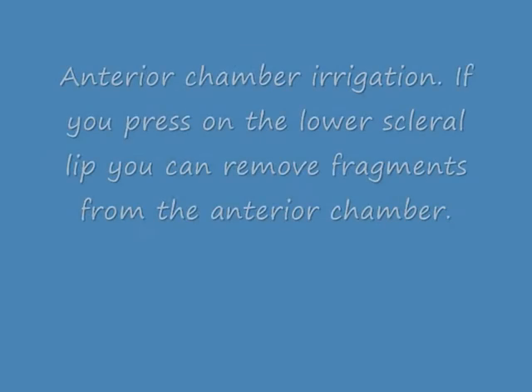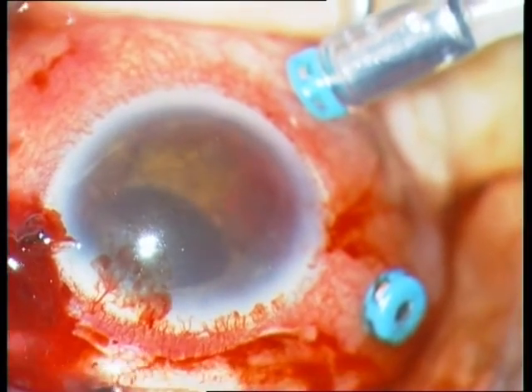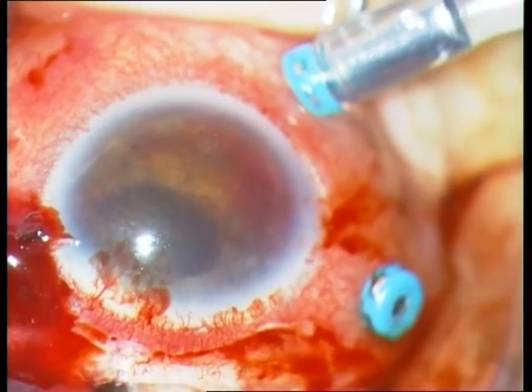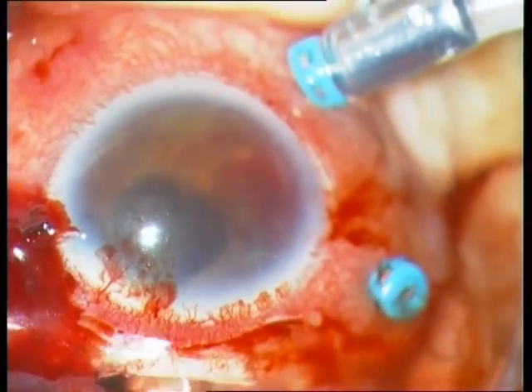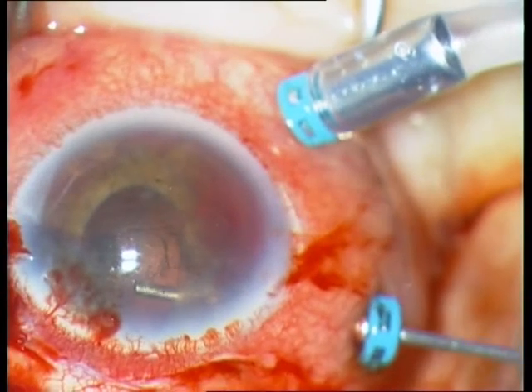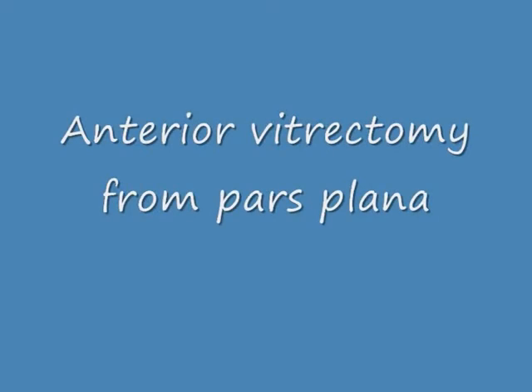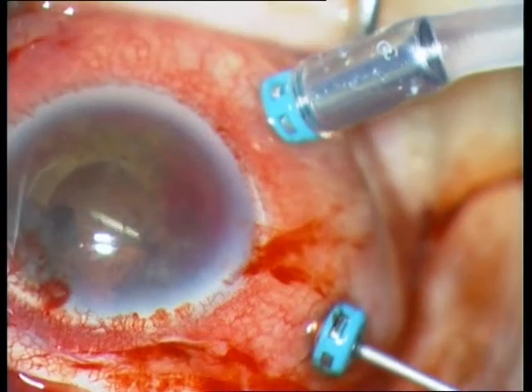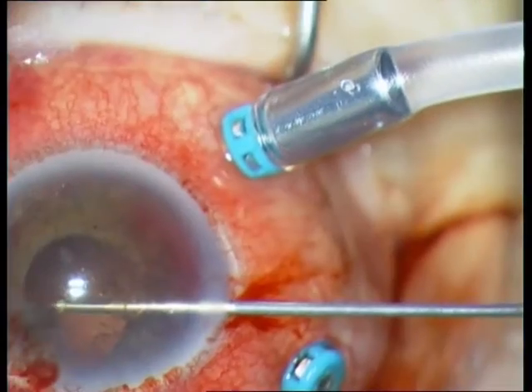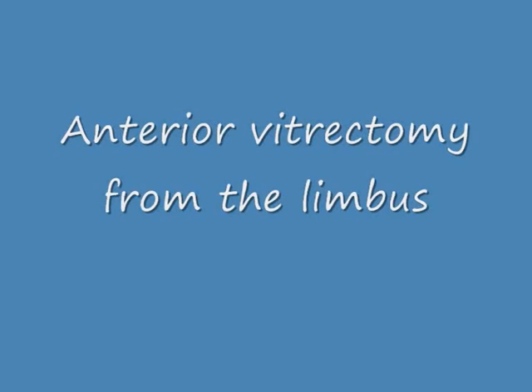Now there is another trick: if you irrigate the anterior chamber from the scleral incision and press on the lower lip of the incision, then you can remove fragments from the anterior chamber — viscoelastics, blood, and cortical fragments. Then of course continued vitrectomy from pars plana. You can also observe some cortical fragments which drop now onto the retina. Then anterior vitrectomy from the limbus.